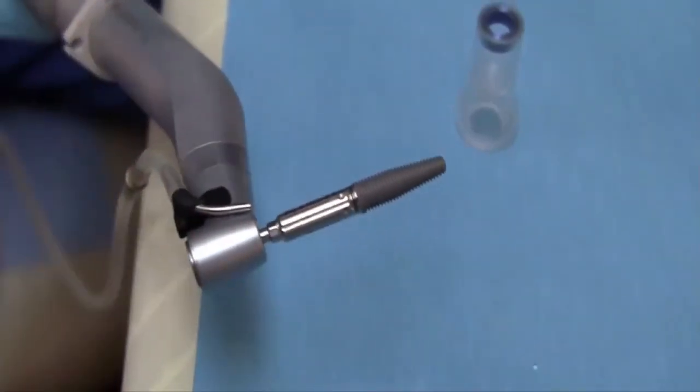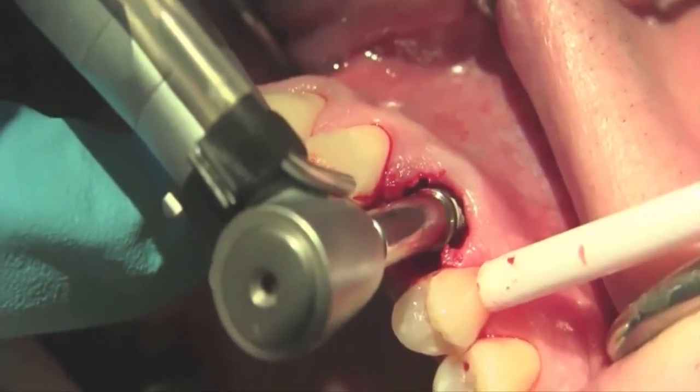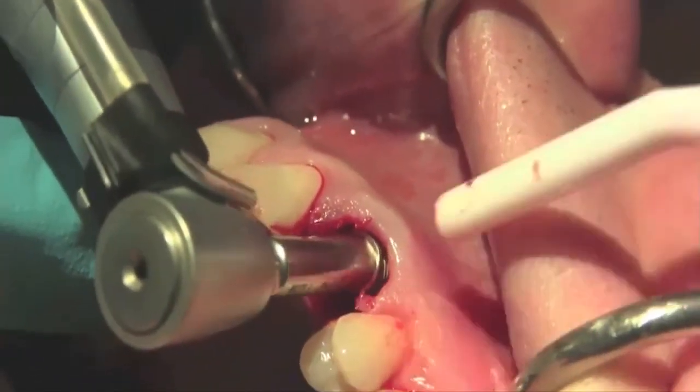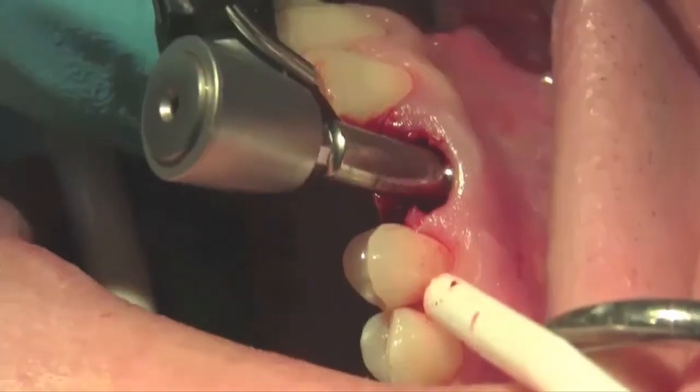It's a platform with an angle in which the most coronal part of that platform is going to have to be on the facial side, and the lower part of the angle is going to have to be on the lingual part. The implant is being taken into the preparation, the osteotomy site, and it's being placed. Again, we're trying to coordinate the dot of reference for the facial placement, so we can do very precise placement for prosthetic purposes.